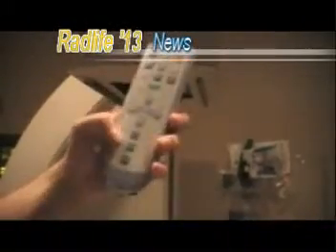Also over here we have a detachable remote which you can control from anywhere in the room, and of course it has the same buttons up top that you find on the tube and down here that you find on the bucky.